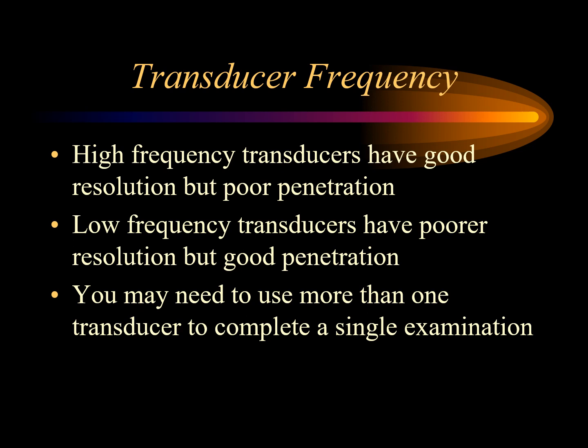So again, there's always a trade-off with each transducer type with resolution and frequency. And again, you may need to use more than one transducer to complete a single examination. That would not be uncommon.